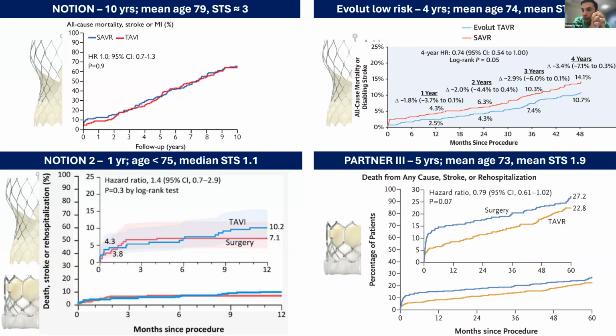So I have a question for you, Antonio, before we go on. First of all, what valve are you going to implant? Because according to that, we can make a short discussion. And second, how do you imagine the future of this patient, the natural history of this valve during the next 10 to 20 years?